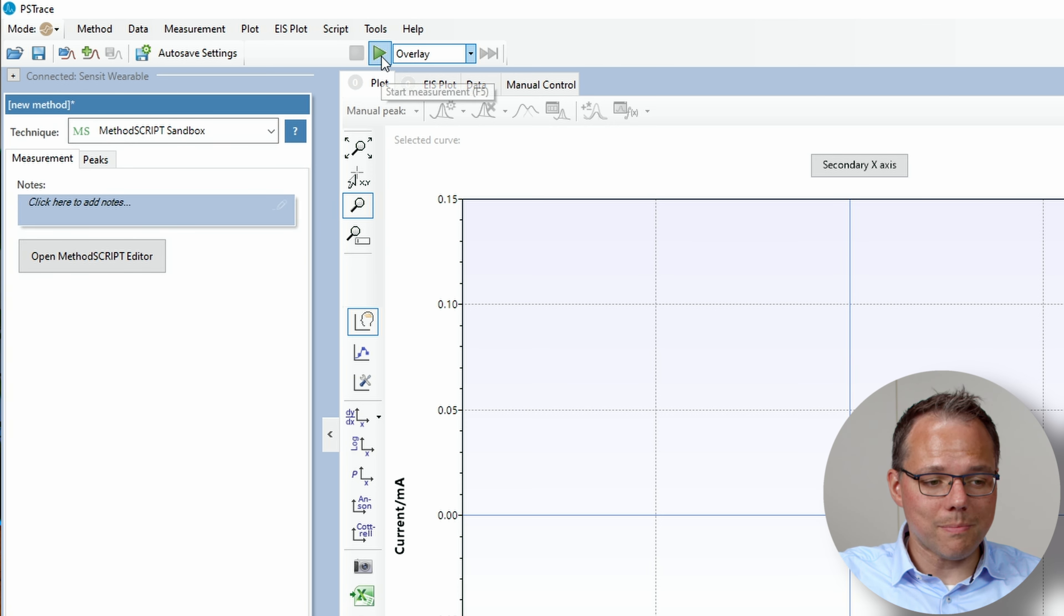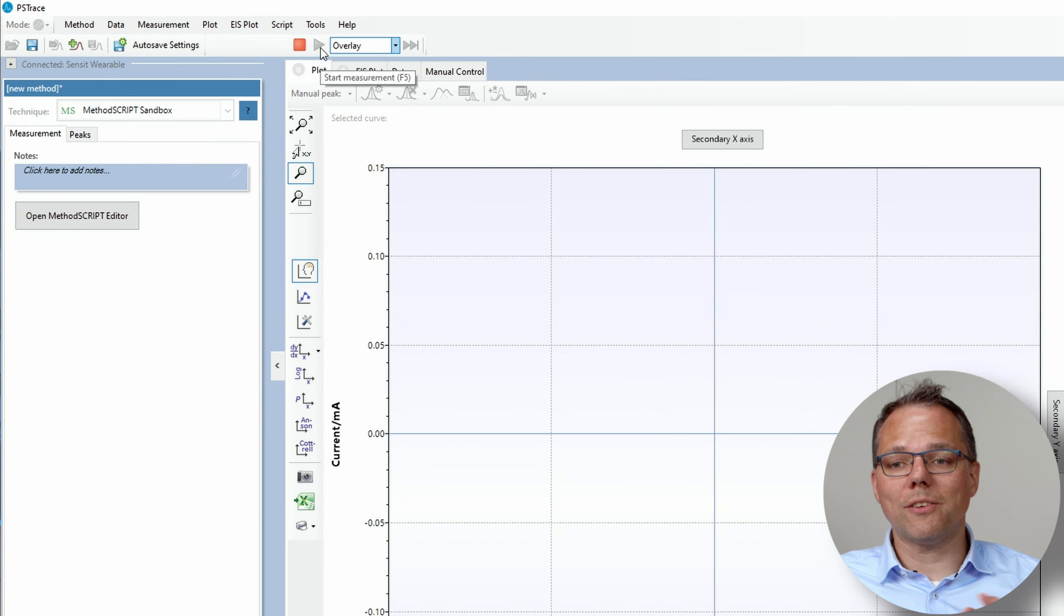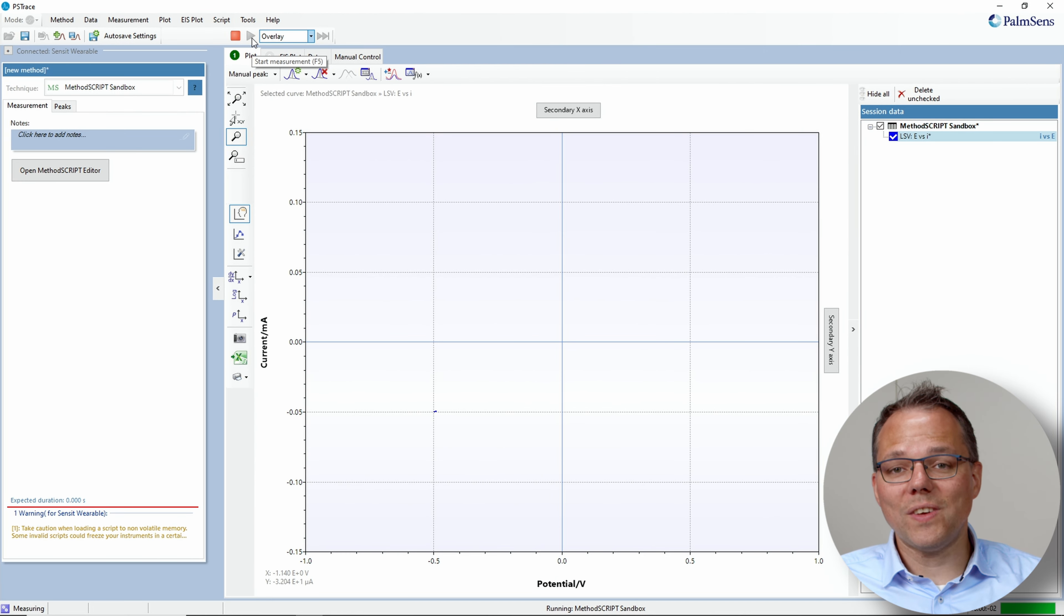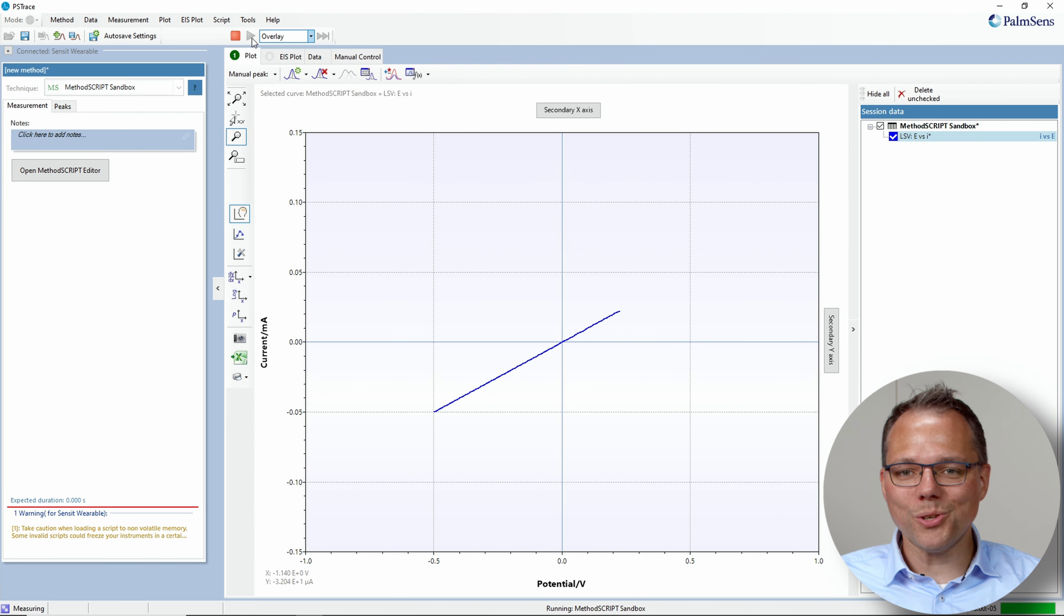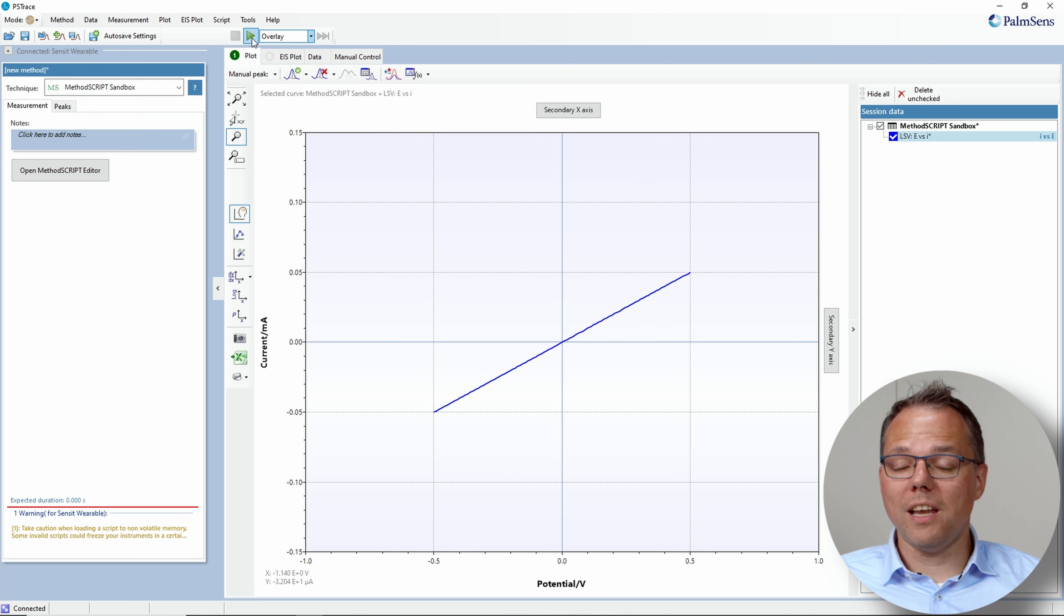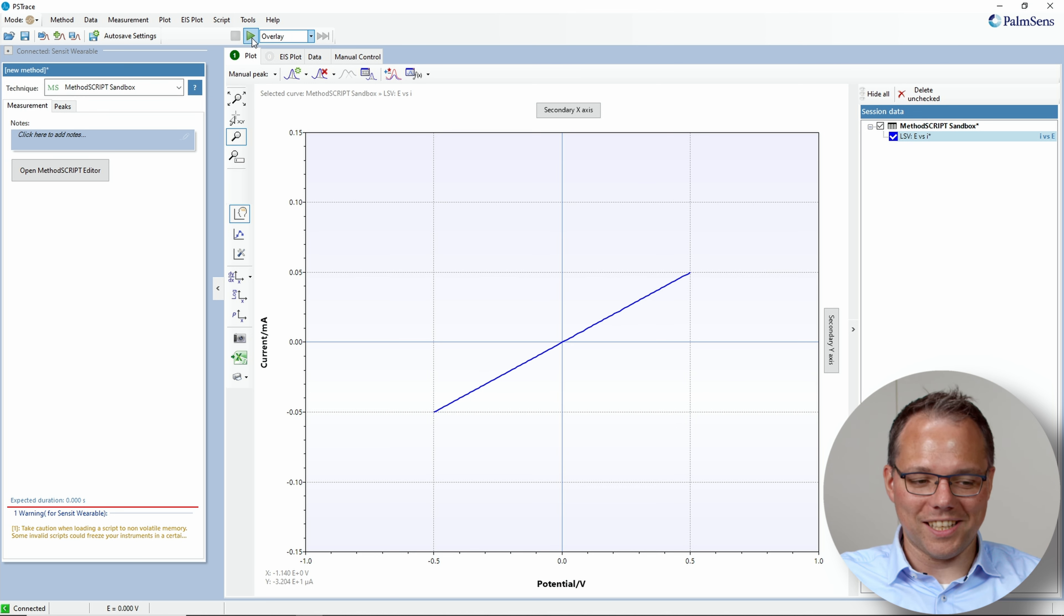Now I just start my measurement and first it's just the regular LSV in PS trace that you're most likely used to. So it's just a diagonal line through the origin of the plot because I connected a 10 kilo ohm resistor. Now that script is loaded onto the Sensit wearable and will start when it is switched on.